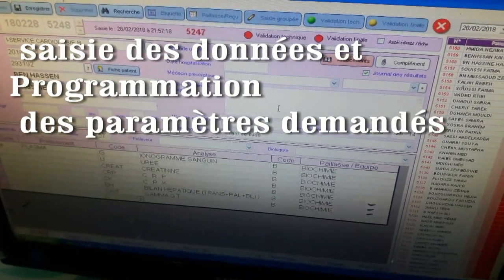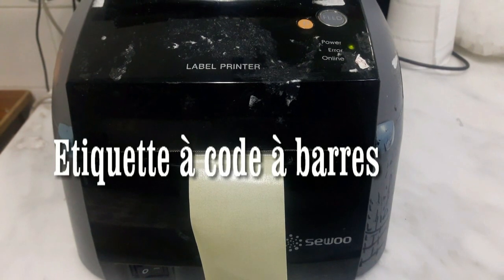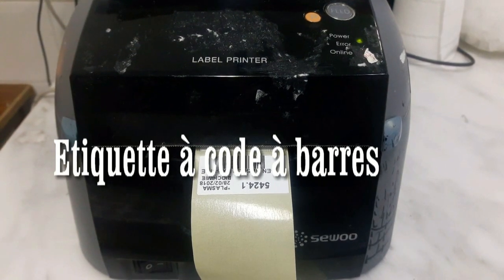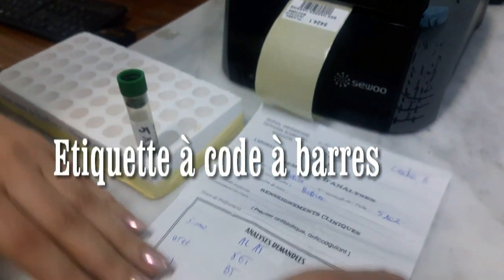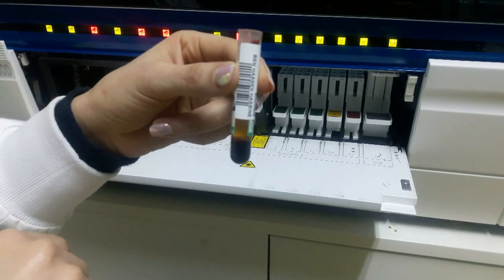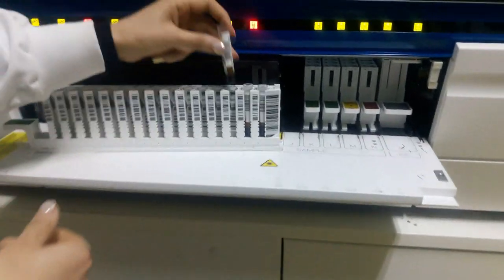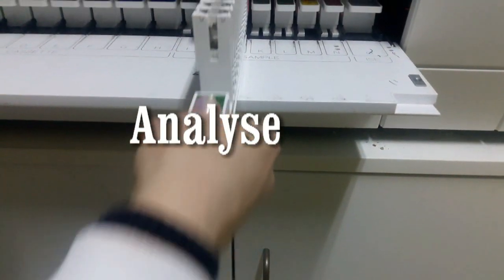On appuie sur F2 pour enregistrer et faire sortir les étiquettes. L'enregistrement de la saisie nous permet d'avoir deux étiquettes : l'une va être mise sur le banc et l'autre sur le tube. Le tube maintenant peut être analysé dans l'appareil. On peut ainsi mettre le tube dans l'appareil Cobas, position 3 par exemple, dans l'enceinte. Et on commence l'analyse.